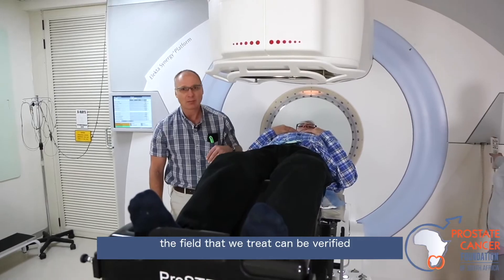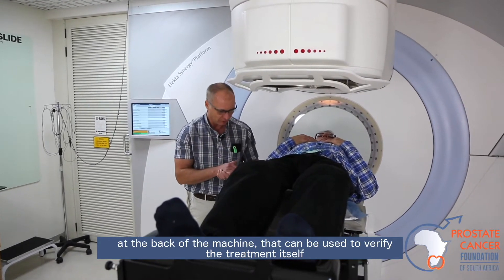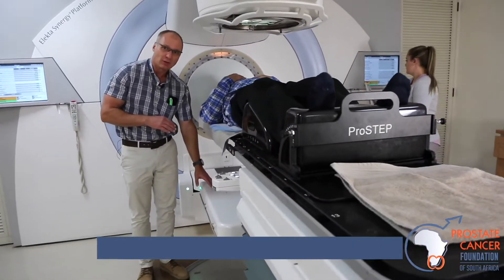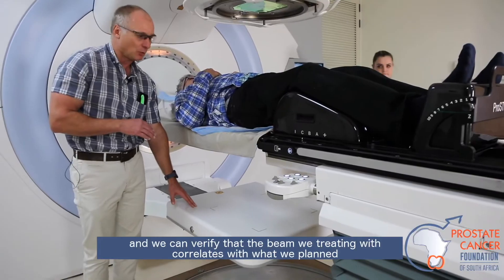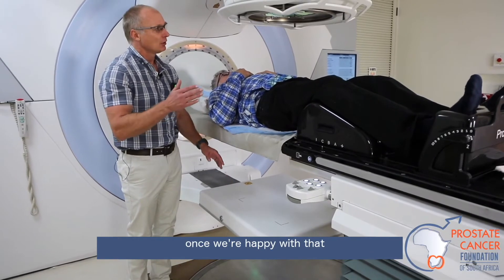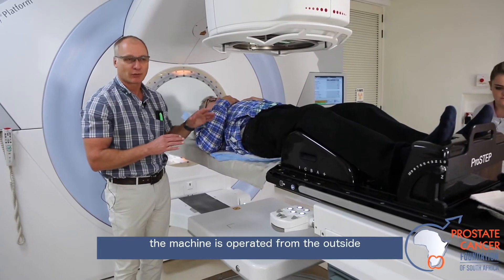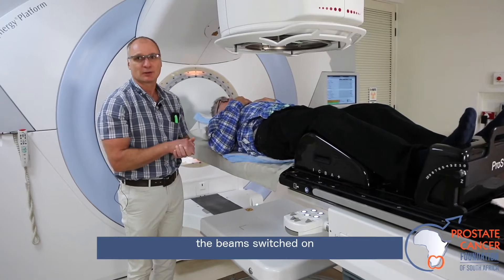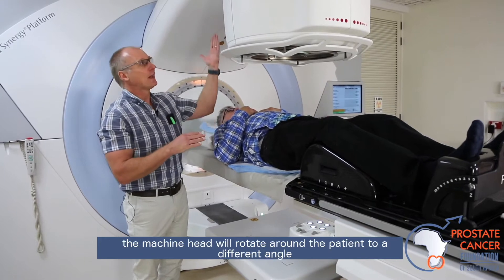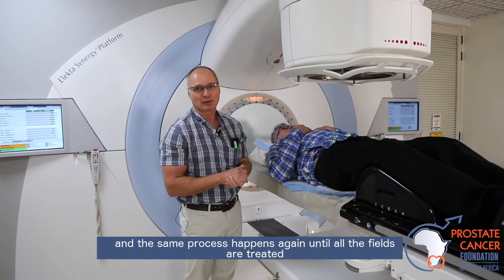The field that we treat can be verified — there's an X-ray panel at the back of the machine that can be used to verify the treatment itself. This panel shifts in below the patient. It's like a normal X-ray panel, and we can verify that the beam we're treating correlates with what we planned. Once we're happy with that, we can start the treatment. The radiotherapists will leave the room, the machine is operated from the outside, the beam is switched on — it might be anything from 1 to 2 minutes per beam. Once the beam is done, the machine head will rotate around the patient to a different angle, and the same process happens again until all the fields are treated.